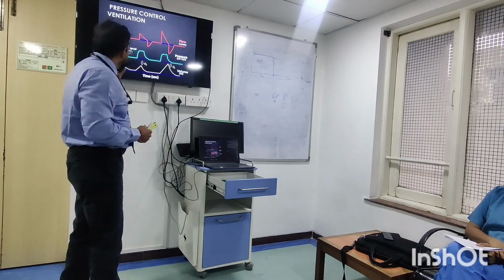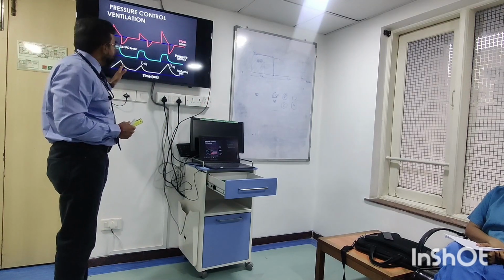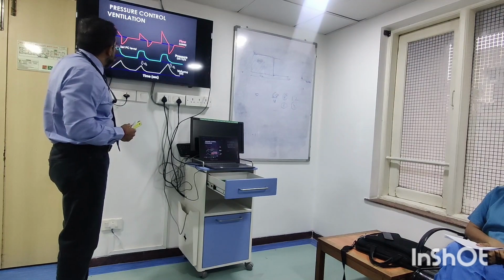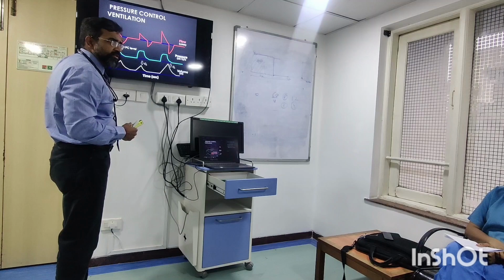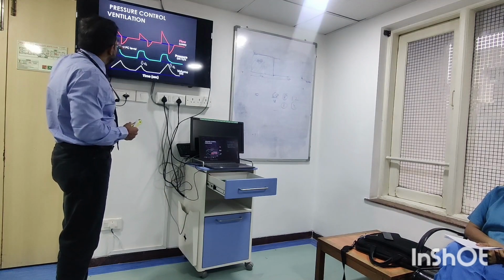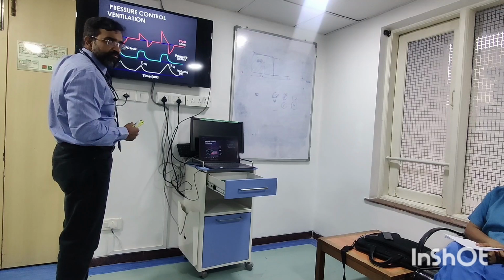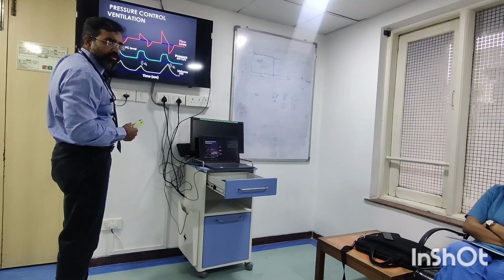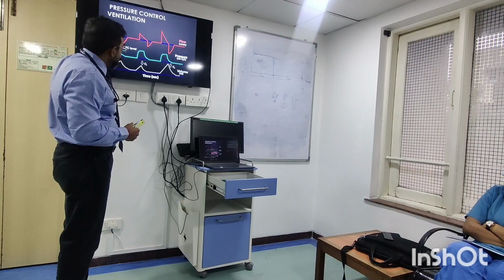Now, we have started a flow inside. Okay. Now what is happening over here? There is a control that has happened over here. It is limited. It's not allowing you to go higher than this. Since it's not allowing you to go higher than this, it is limited at this pressure. So what is the limit here? Pressure. Okay, and what is the cycling over here?